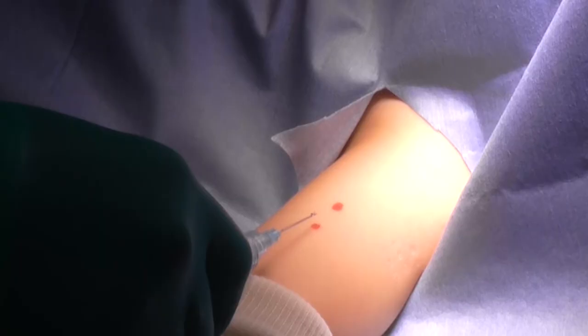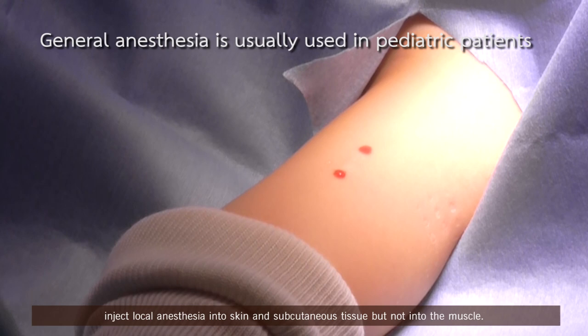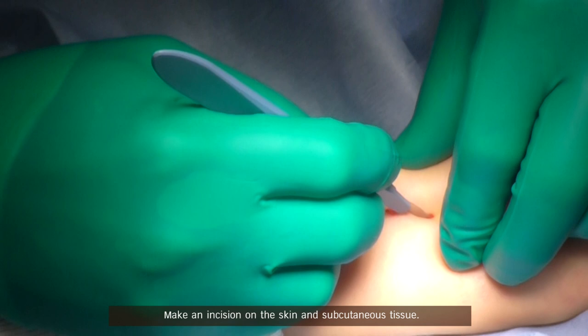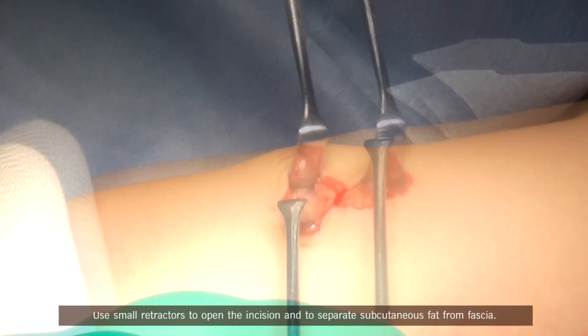After skin preparation and draping, inject local anesthesia into the skin and subcutaneous tissue, but not into the muscle. Make an incision on the skin and subcutaneous tissue. At this point, a portion of skin can be cut for fibroblast culture. Use small retractors to open the incision and to separate subcutaneous fat from fascia.